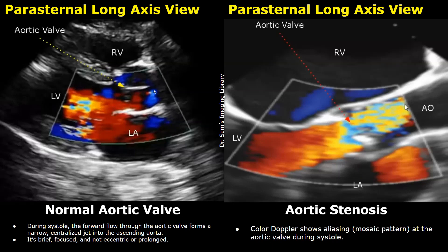In aortic stenosis, especially moderate and severe stenosis, color mixing will be seen at the aortic valve and in front of it during systole. You will see many bright colors — a mixture of yellow, orange, and blue — at the aortic valve during systole.